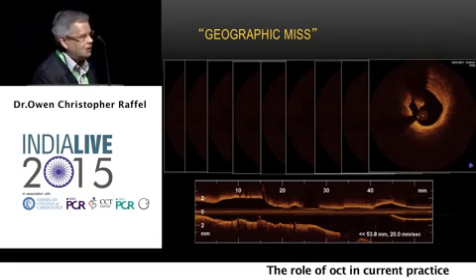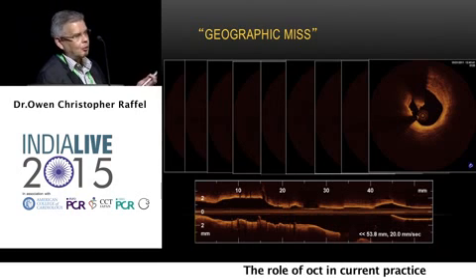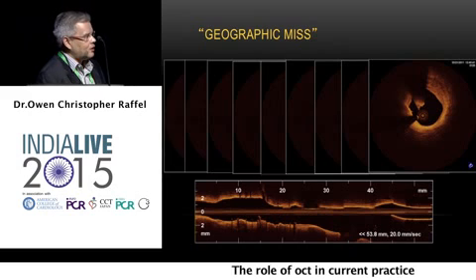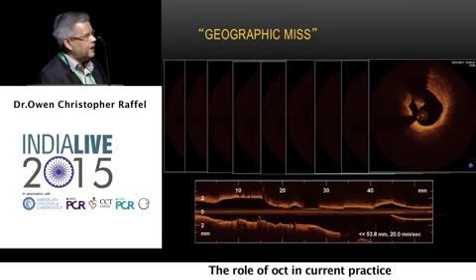geographic miss. We stented the lesion where it looked the severest, but as autopsy studies have consistently shown us, sometimes the actual culprit is a lot more proximal. And this is where OCT helped.